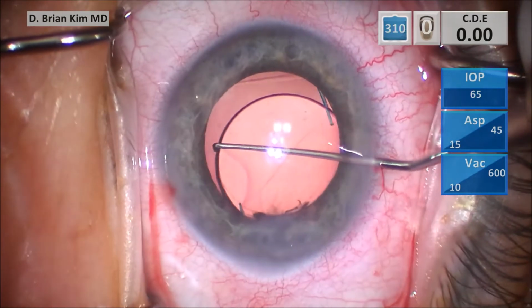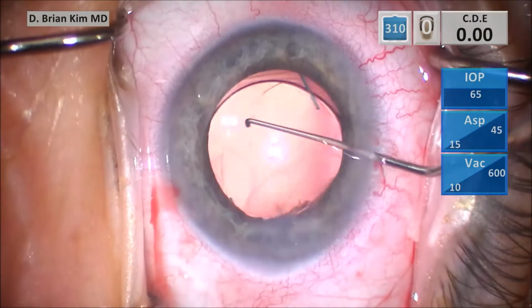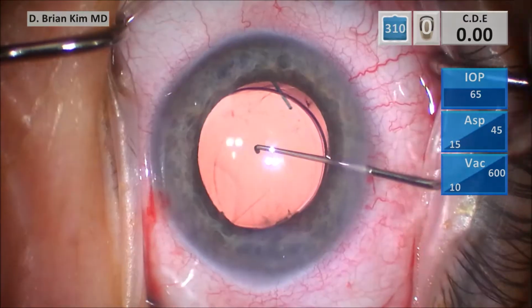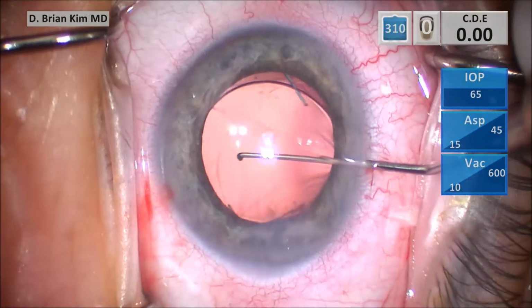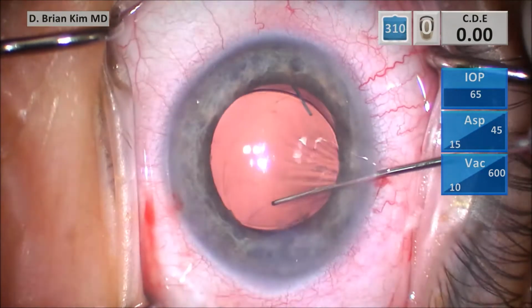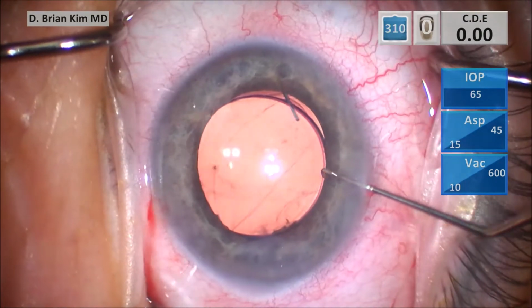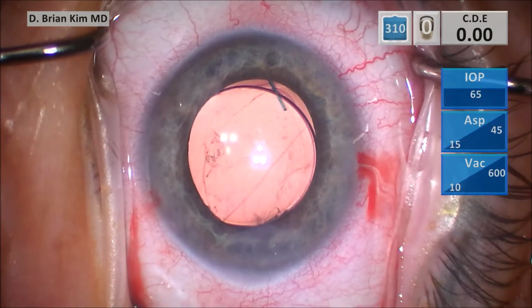So I'm using the Sinskey hook to grasp the optic on the other side, and I'm tucking the optic around the anterior capsule there on each side. And I'm essentially creating an optic capture configuration here. And you saw I did this essentially with no viscoelastic or anything.